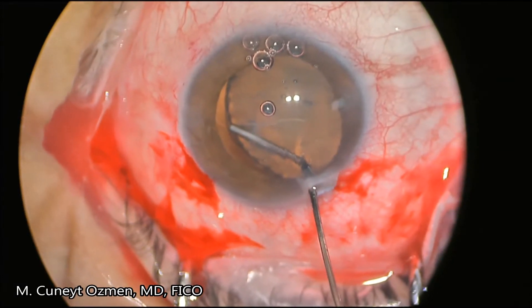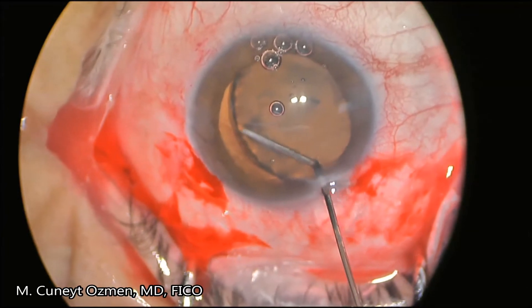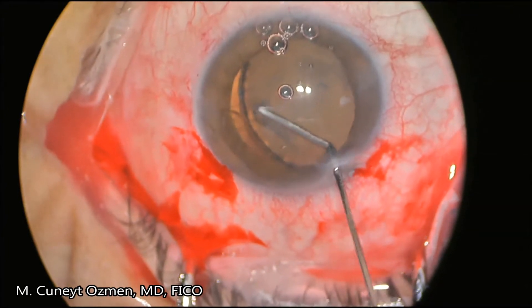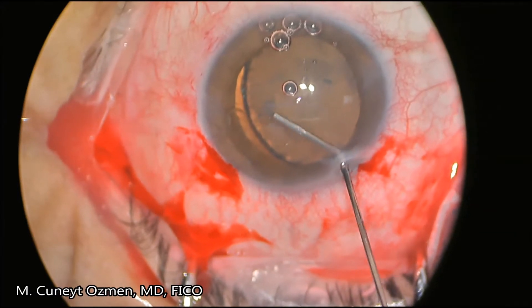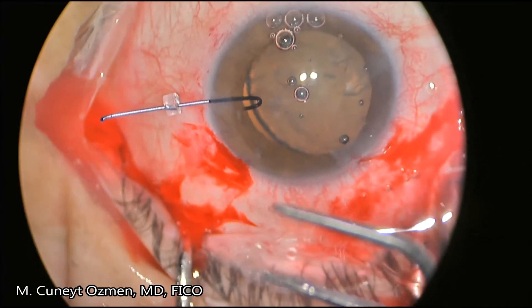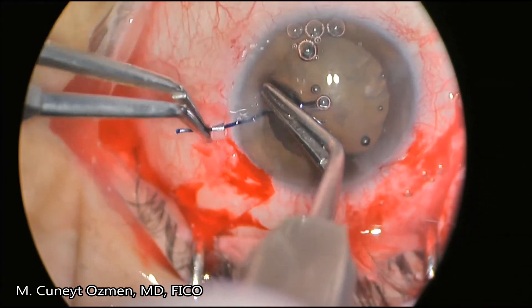Right now you can see the fluid wave between the lens material and the capsule. After hydrodissection, we are not rotating the lens material, but we need to stabilize the lens and capsular complex.